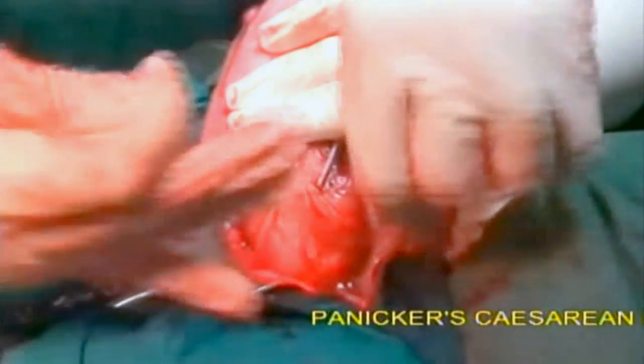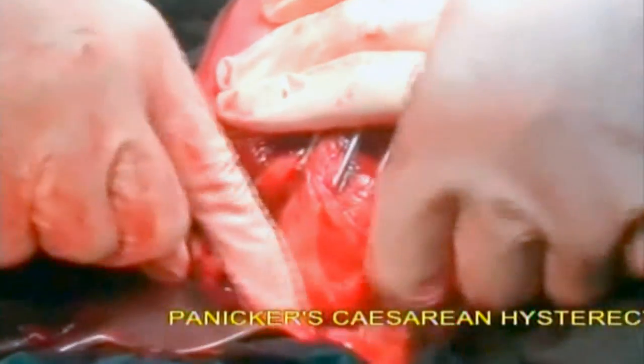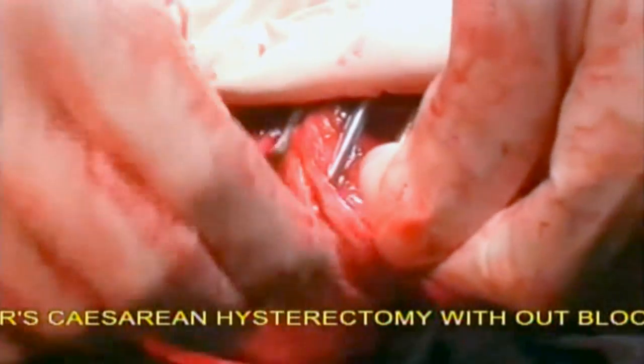Now all the blood supply to the uterus is occluded and you can proceed with obstetric hysterectomy — that is, cesarean hysterectomy — or uterus-saving procedures.